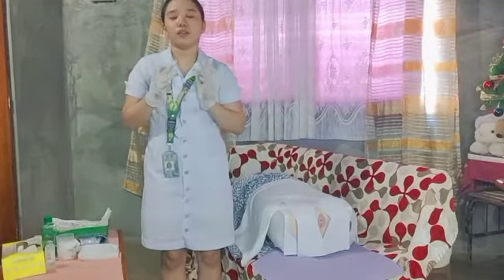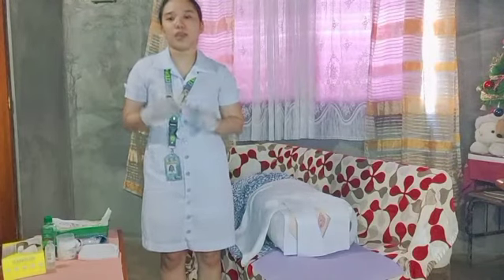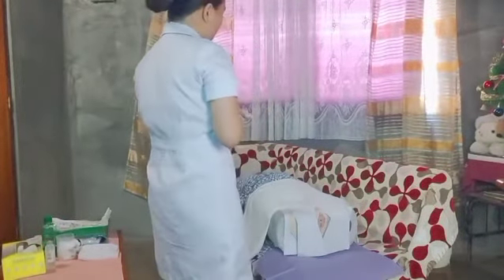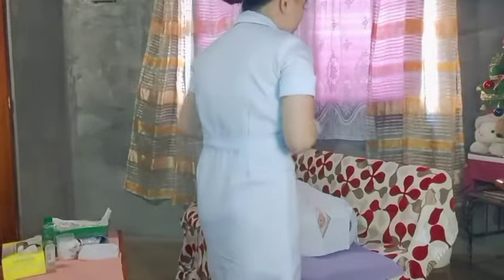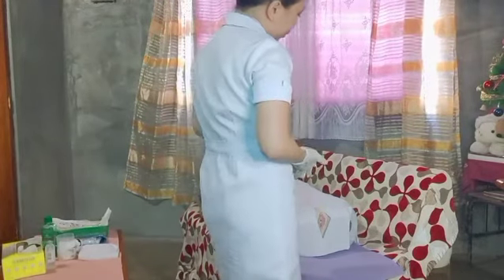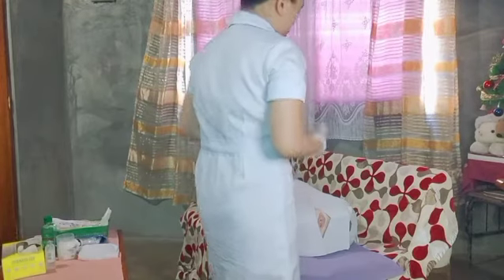So, now we are going to start inspecting the perineal area of the patient. Okay? So, ma'am, I'm just going to inspect your perineal area. Okay. So, as I inspect, the patient's perineal area has no lesions or lumps. There are also no abnormalities as I observed.